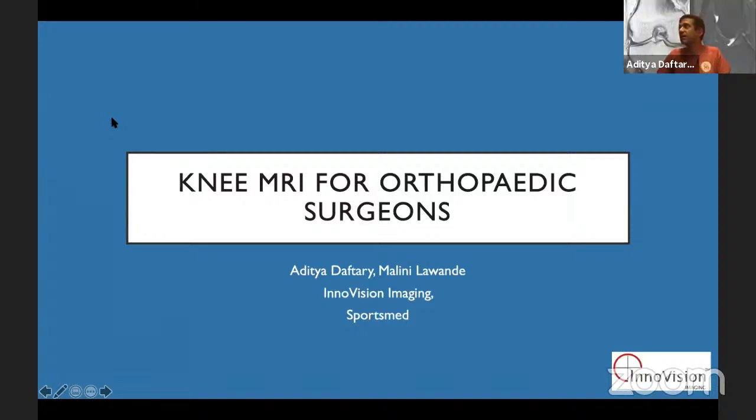Thank you. May I have a question? Yes. While ordering, while asking for an MRI, if you are looking for an ACL injury, is there anything specific we should give in the requisition to an MRI center?